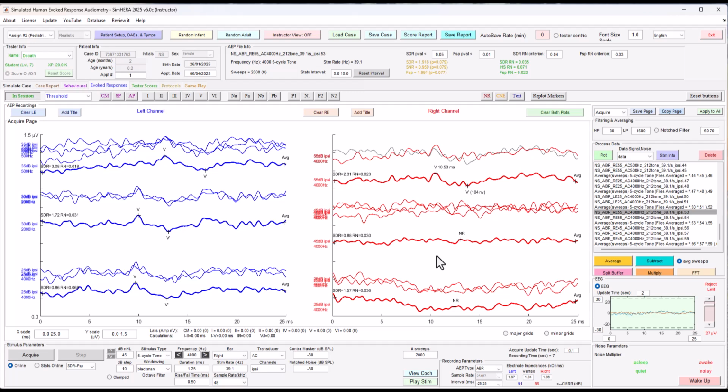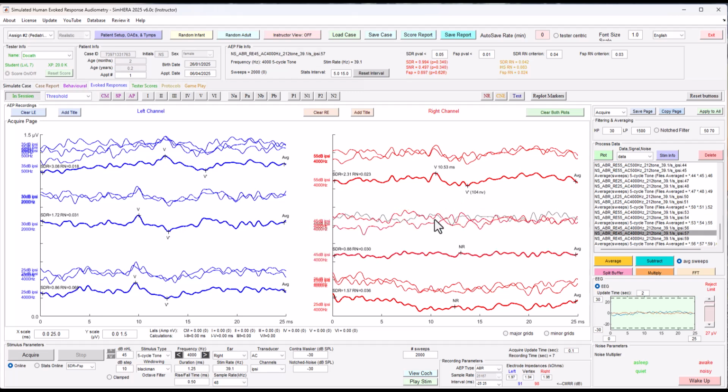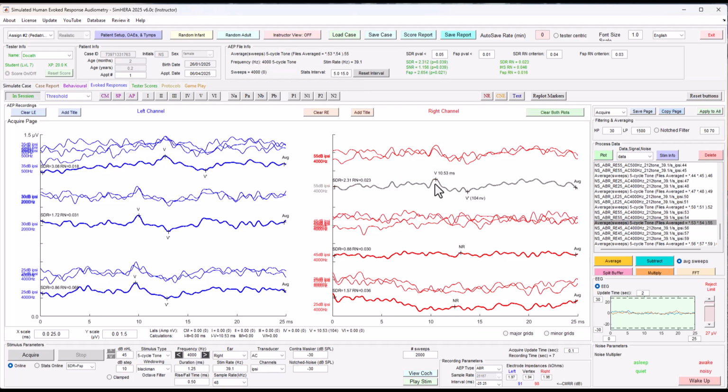In this case, it is not, but because the infant's sleeping, we're going to go ahead and evaluate at 1000 Hertz, because that will help the clinicians manage this child if we know that slope, and helping for fitting of hearing aids if they choose that option. Okay, so I believe we've got everything that we need for the 500, 2000, and 4000 Hertz thresholds.